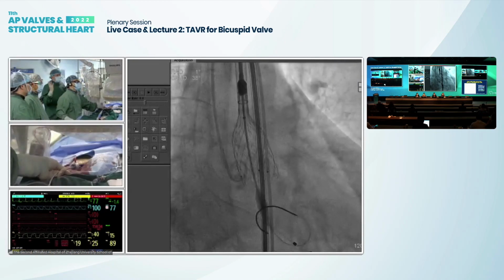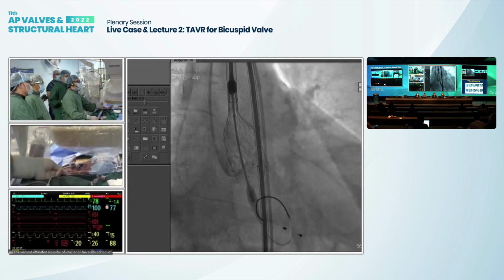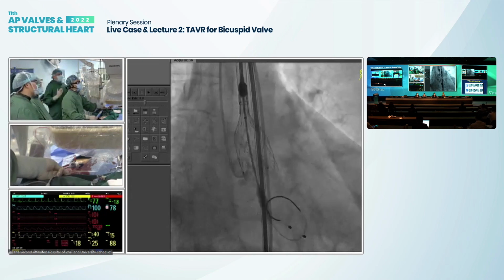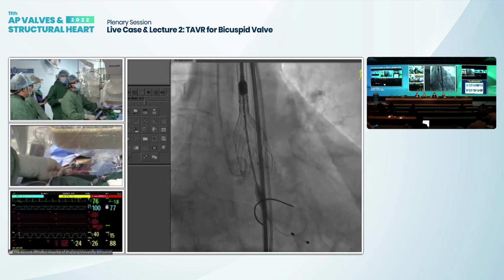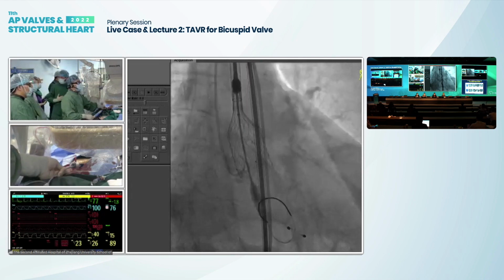On the left coronary side it is already deep. On the non-coronary side, it is a little high, even 1 millimeter above the annulus. The second shaping, we don't know what is going on. Regularly, the left side will be up further, and the non-coronary side will be down a little bit. But it's a challenge to make a correct judgment.